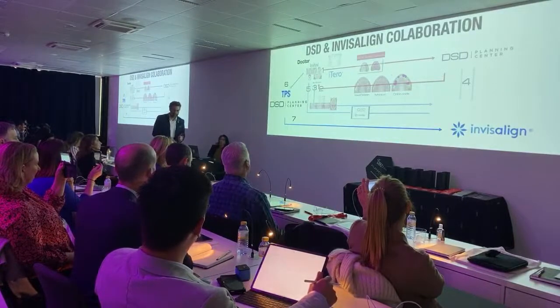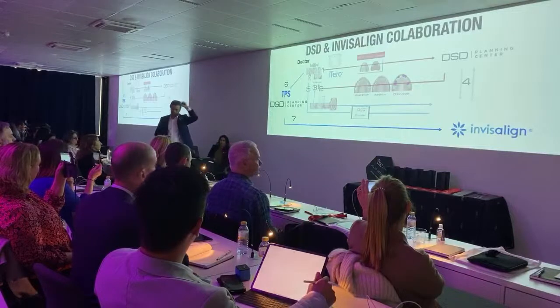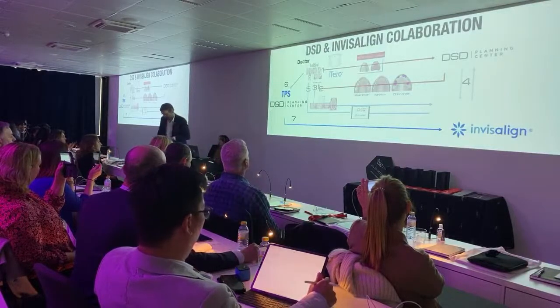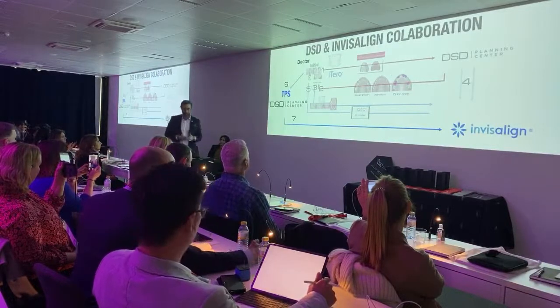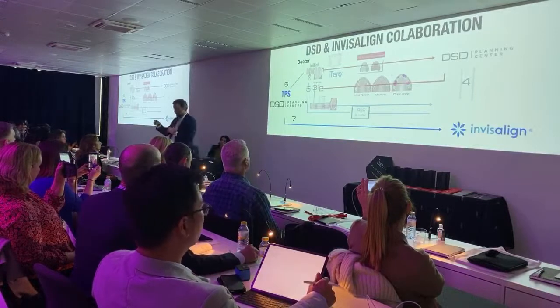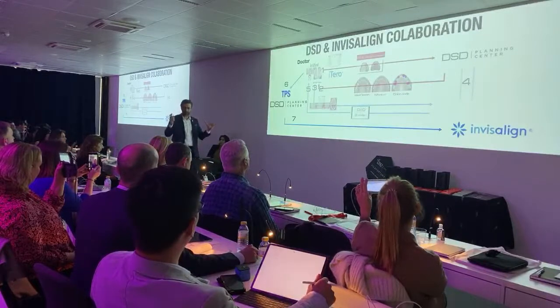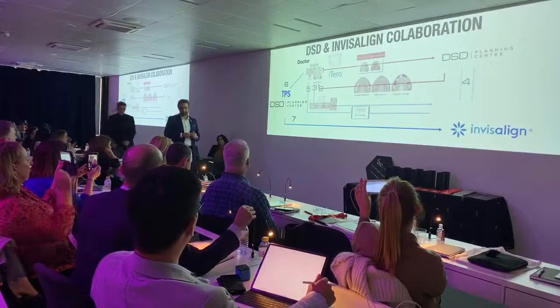So for every case that you receive, you have an option to select, I want this case to go to the planning center, TPS. And the case will come to us. We will do first quality control, of course, making sure everything is okay in terms of the DSD design, the pictures, everything. And we will suggest at first any modification that we see is necessary according to DSD.